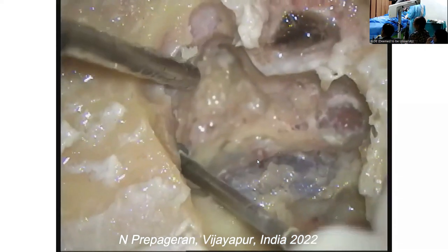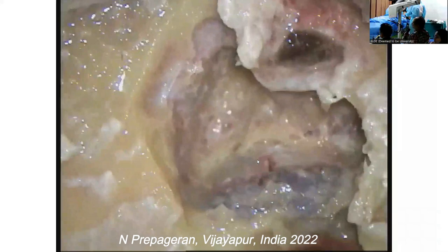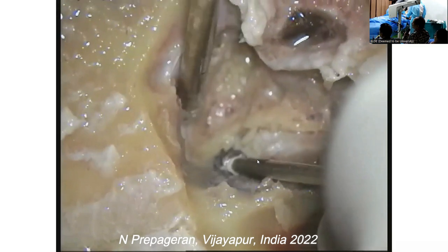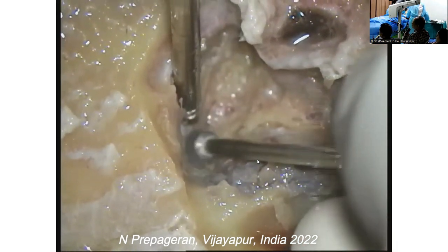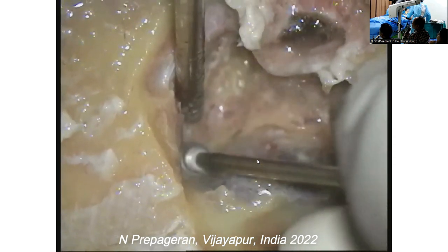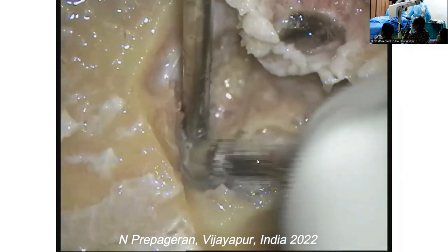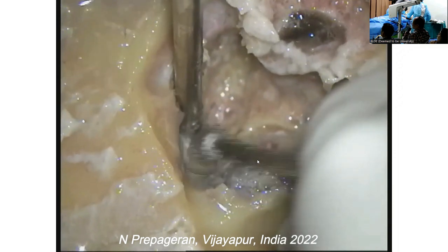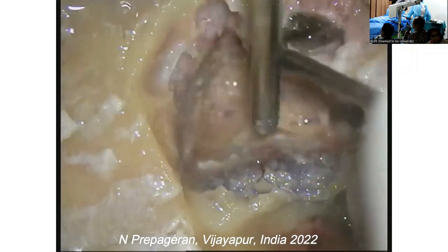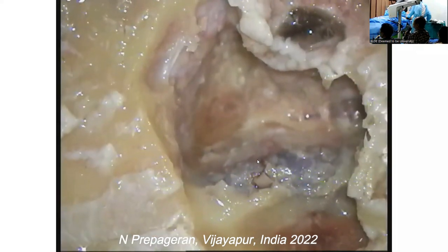Okay, guys. Let me go here, and let's see whether there is the sinodural angle. As long as the drill doesn't kick back like a motorbike, we're okay. Can you see, guys? See? This is what I was telling you about. You saw the kick? So that's how the drill kicks.